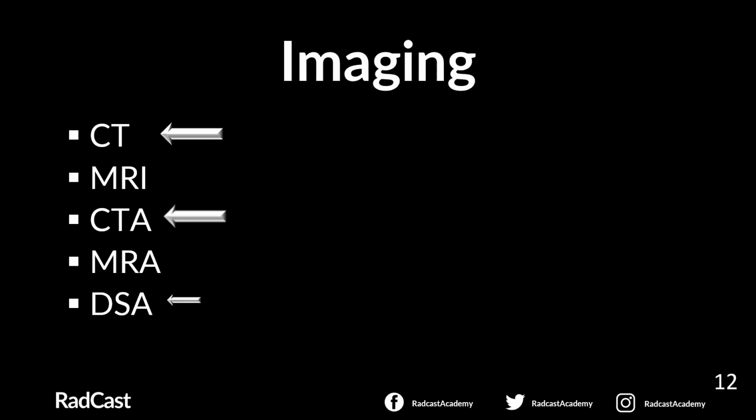After the diagnosis of subarachnoid hemorrhage is established, it is important to know the source of bleeding, I mean the exact site of aneurysm. That is why we use CT angiography. It doesn't look for blood in the subarachnoid space, but it will show us the site of the aneurysm and in which vessel.